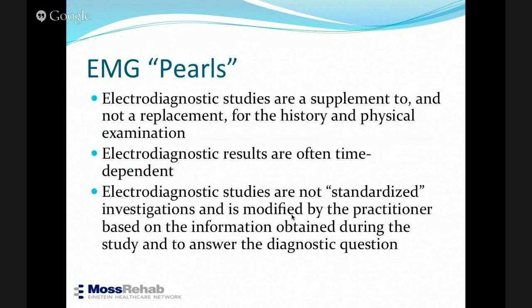EMG is a supplement to, and not a replacement for, the history and physical exam. If you don't do a good history and physical exam, you're going to get a poor EMG study. The findings are often time dependent. Early on, there may not be that many changes, as we talked about. Fibrillations and positive waves take about 3 weeks to develop. Electrodiagnostic studies are not standardized investigations and are modified by the practitioner as needed. So it's an important thing.